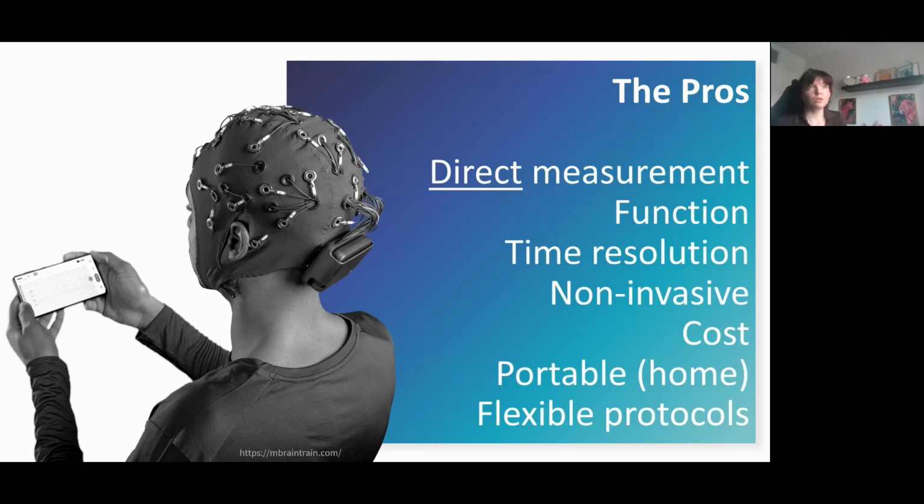Additionally, EEG is very portable. So we have wired systems that can be easily brought to clinical trial settings and set up there, but also, with the development and improvement of more mobile systems with wireless amplifiers, such as the one I'm showing here, the Smarting X Pro system, you can even allow people to move around without being plugged into any sort of immobile device. So, for example, you could set up your participants in the morning of the trial with the EEG cap and leave it on fairly comfortably all day for continuous recording or numerous recording points.